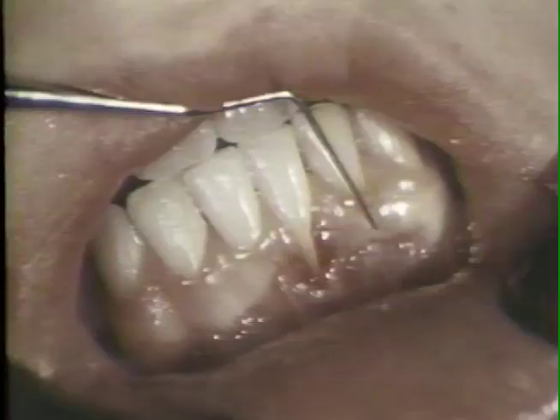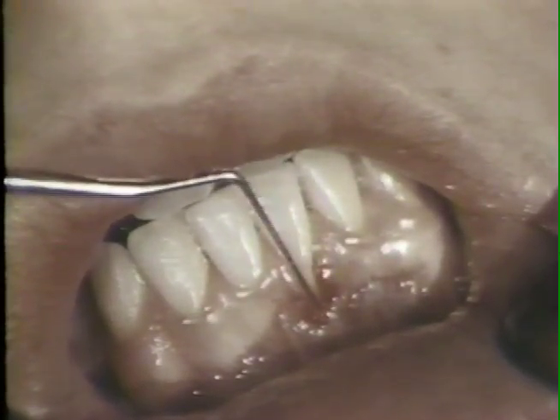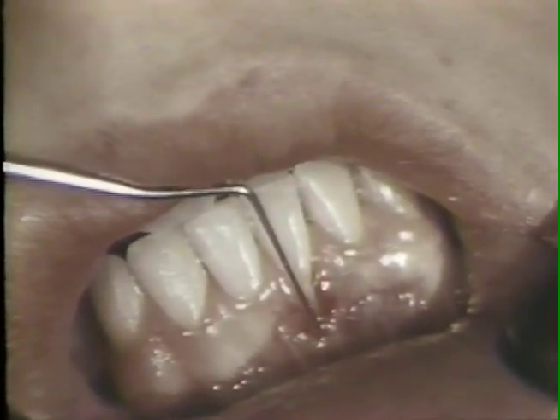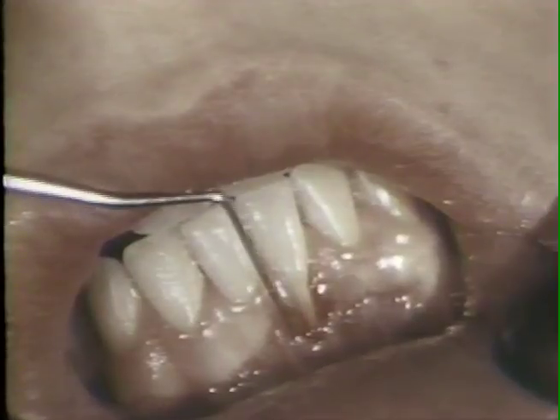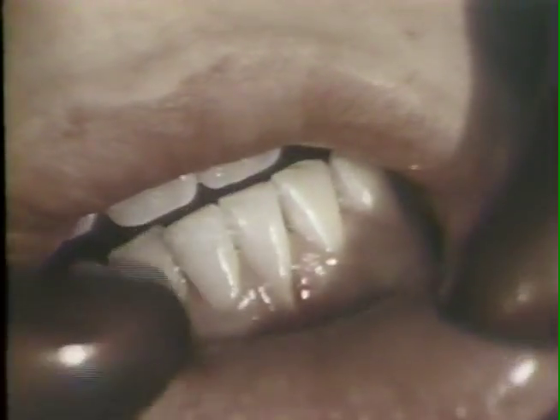At the bottom of the gingival cleft, the sulcus extends apically to the mucolabial fold. The distance from the cementoenamel junction to the free gingival margin at the cleft is 6 millimeters. Pull on the lip moves the free gingival margins associated with the cleft.